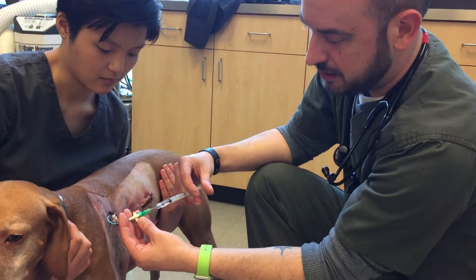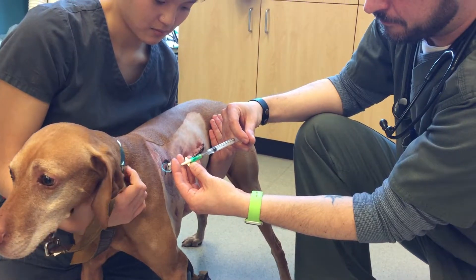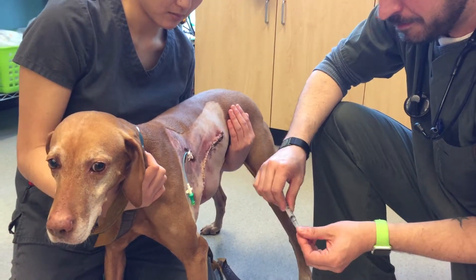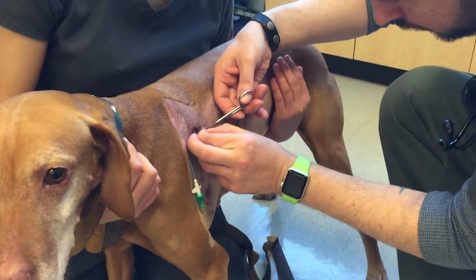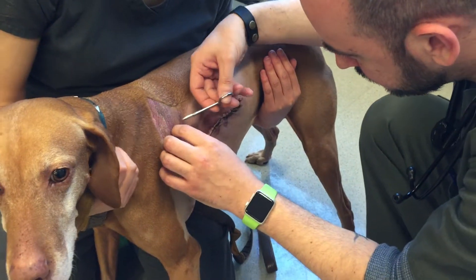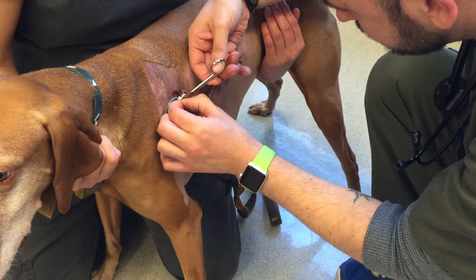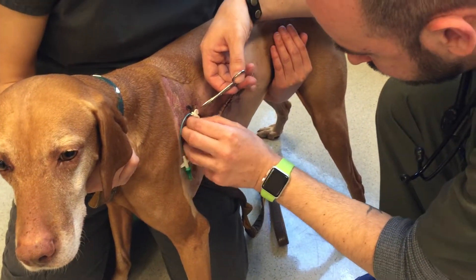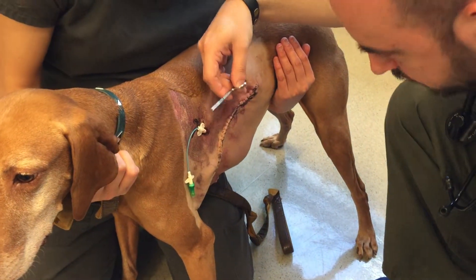As you can see, this is extremely comfortable for her — it's not painful at all. There are just a few tiny tack sutures holding the catheter in place, so we're going to go ahead and snip those sutures. All three sutures are now out.